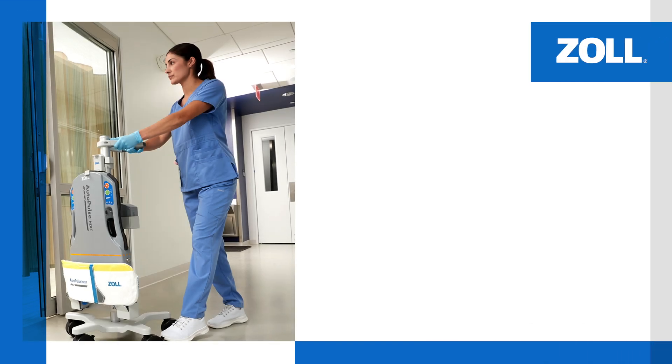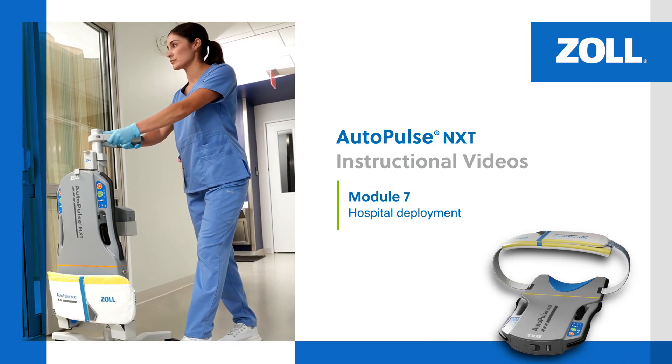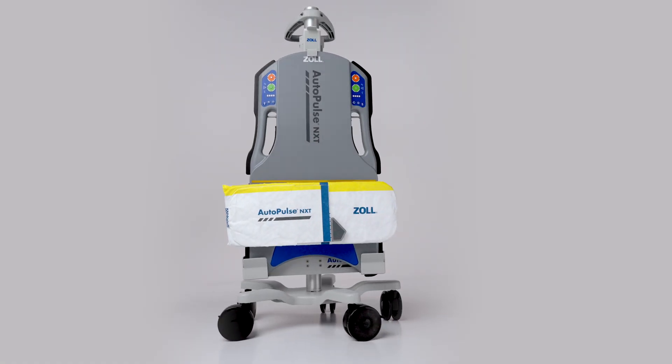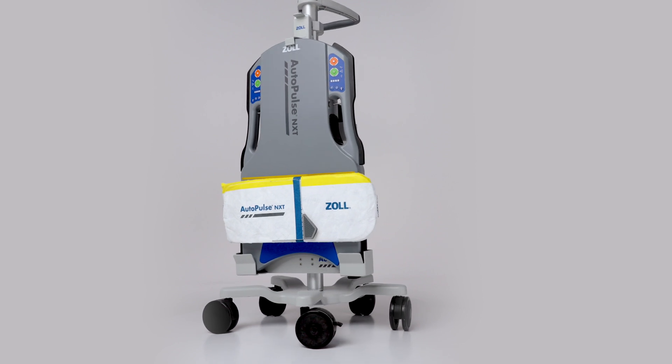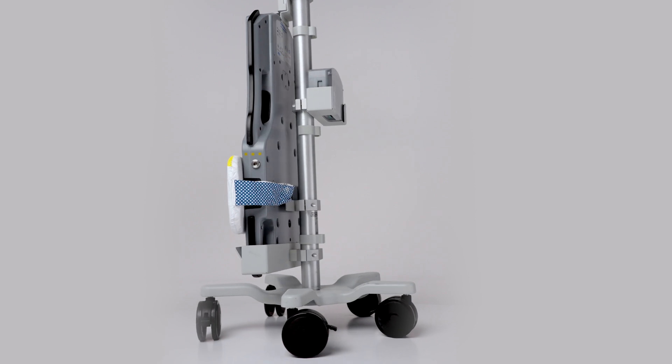In this module, we review how to deploy the AutoPulse NXT Resuscitation System in the hospital setting. The AutoPulse NXT can be stored on the transporter for quick and easy access. Watch the preparing for hospital deployment video to ensure your device is ready for use.